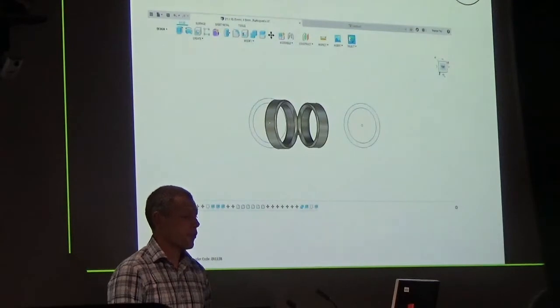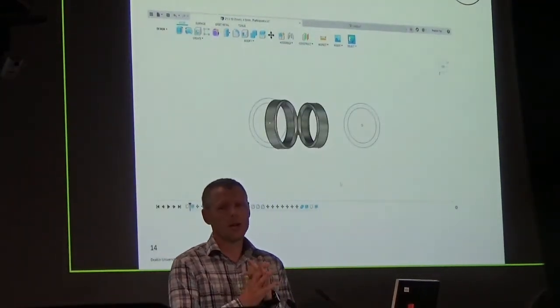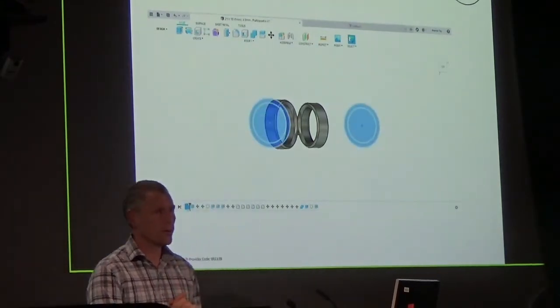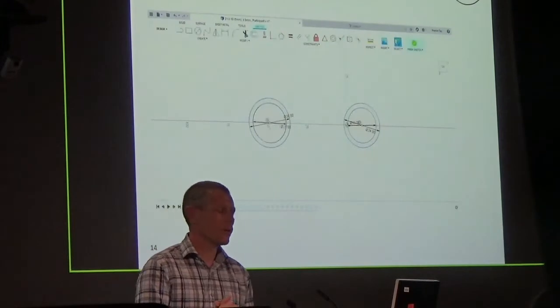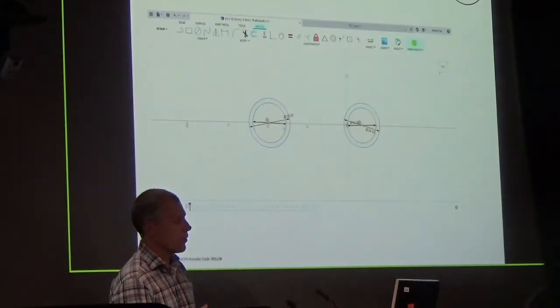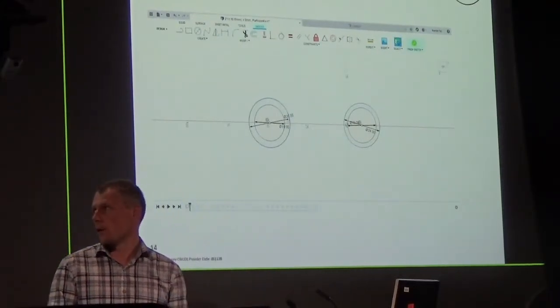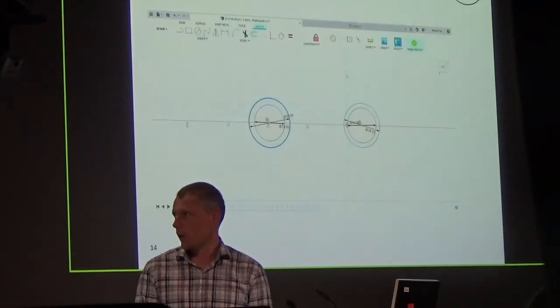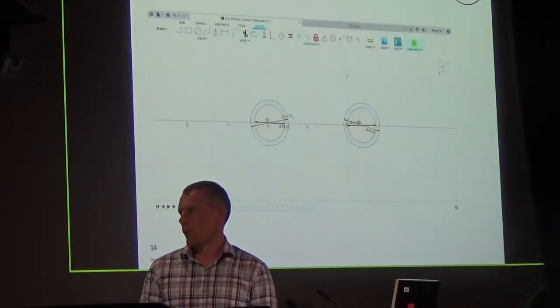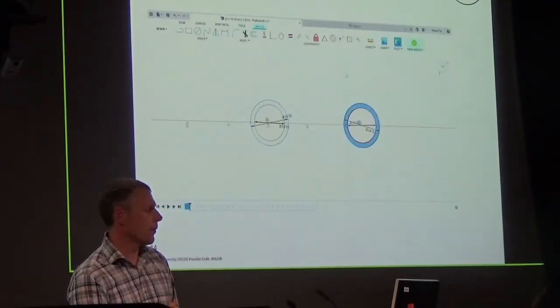So what you can actually do is simply go back to the very first step of the design process and change the numbers at the very start, which I'm doing in this video. So those numbers that I drew at the very start, the 20 odd, I'm modifying those to the new size of the person's finger, and changing the outer circle to match up with this, and maintain that 3mm or 5mm in this case size for the circle.